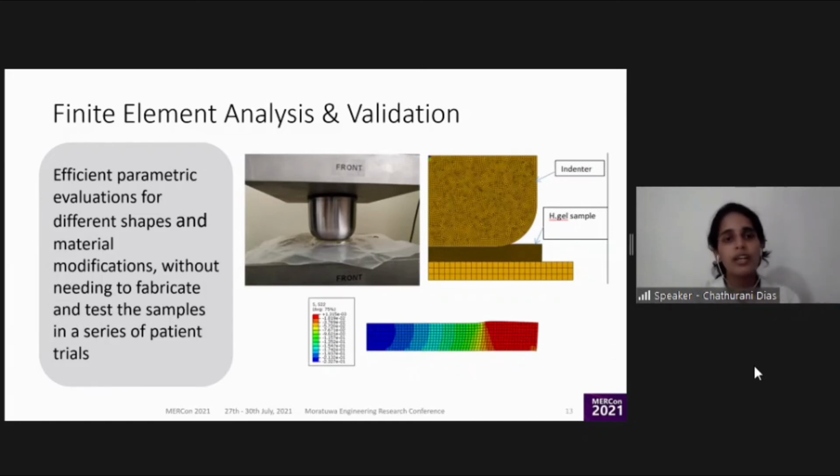The reason I shared this with you is to show that interface pressure measurement in biomedical applications does not only come up in clinical studies with people, but can also be extended into material tests and biomechanical tests in non-human studies.